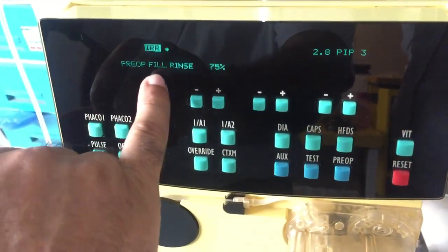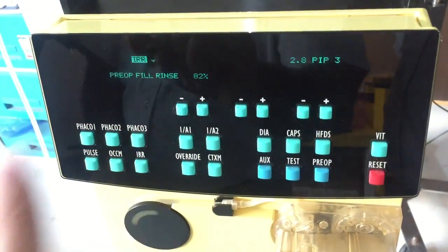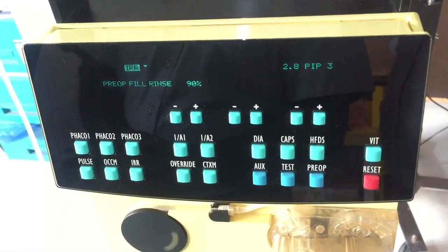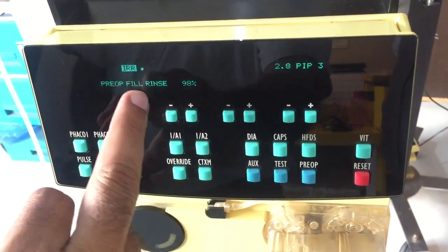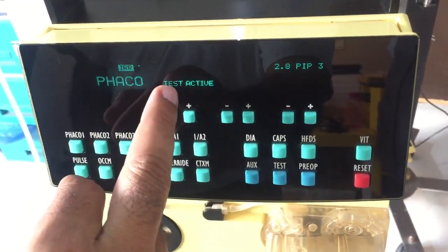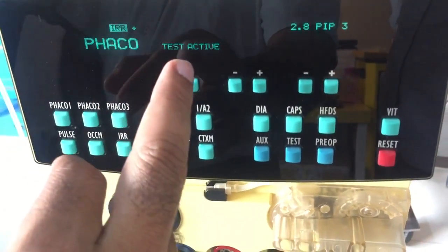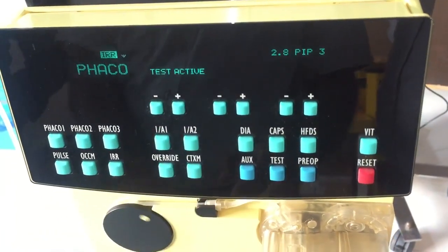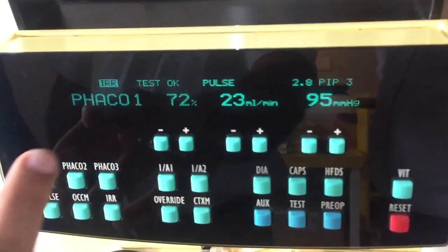The pre-op fill and rinse is running, and here is the percentage of completion of the pre-op, and after it reaches 100%, it will show the phaco test active, and then you will see the message phaco test OK, and you will also hear the noise of the ultrasound from the handpiece. It is OK, then the system will automatically go to phaco 1.